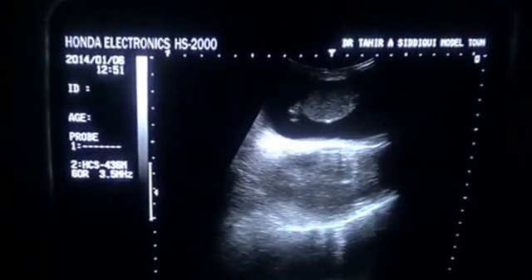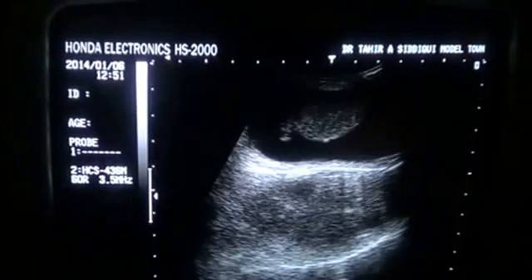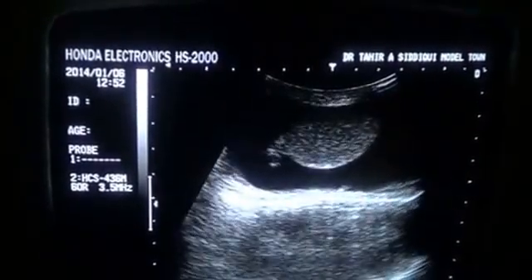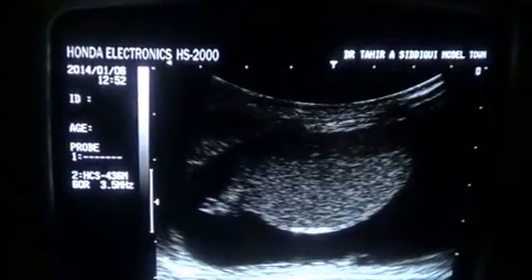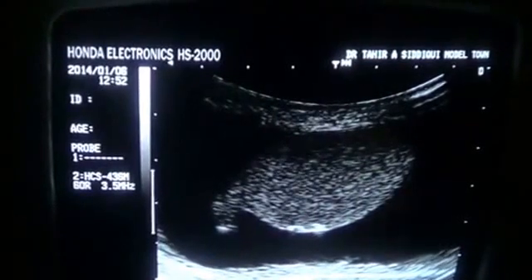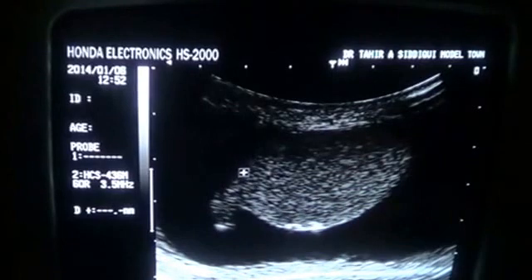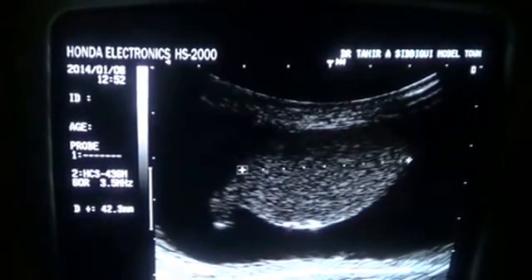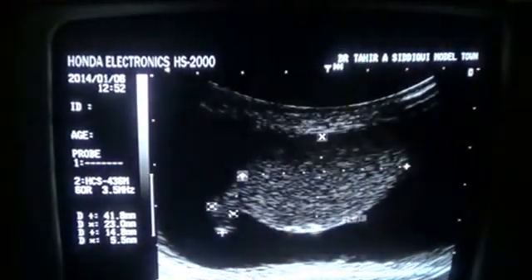This is a scrotal ultrasound of a 40-year-old male in which you are seeing the right testis in longitudinal section along with the epididymis. The right testis in longitudinal section measures 4.1 by 2.3 cm. The epididymis measures 14.8 mm by 5.5 mm. All of this is in the right hemiscrotal region.